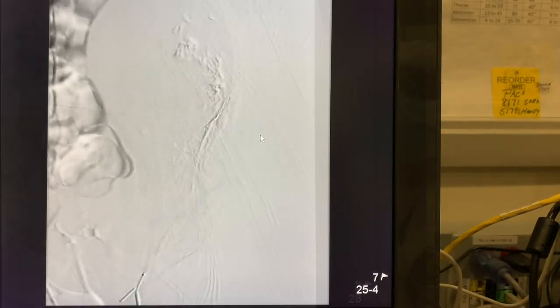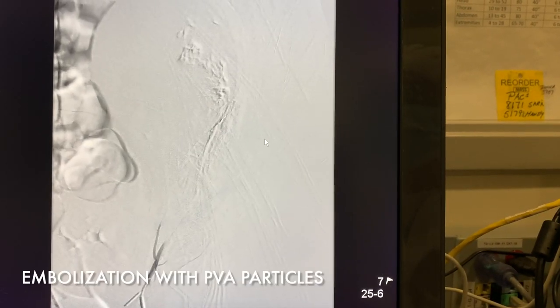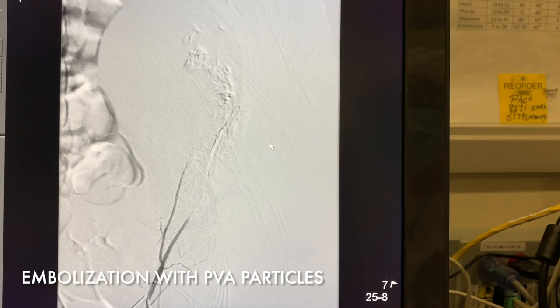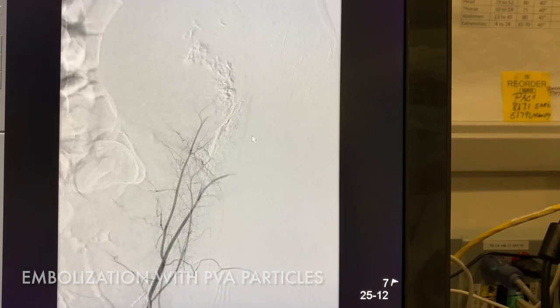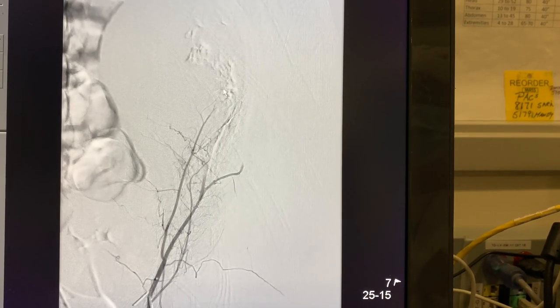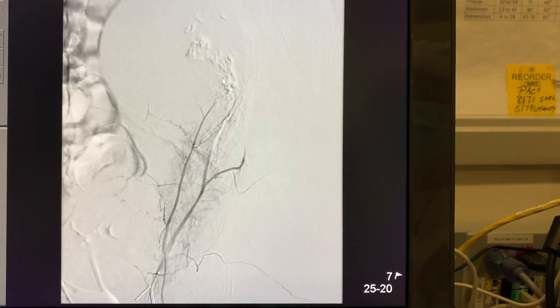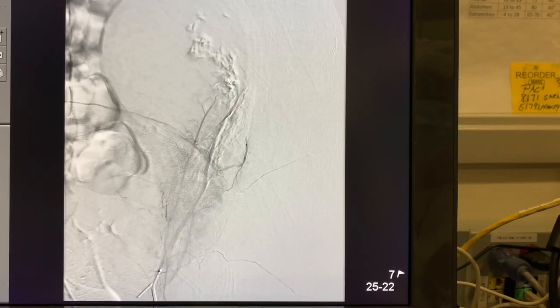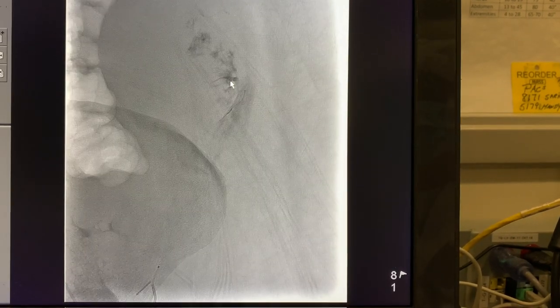This is after embolization of the same artery, and as this contrast is being injected, what we see is the absence of the bleeding artery and the absence of any further extravasation. This is successful embolization.